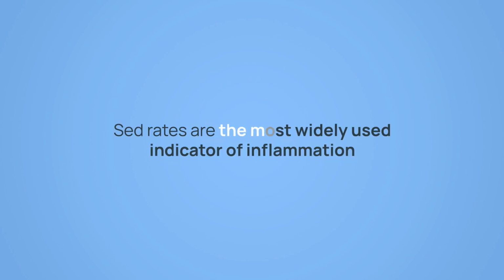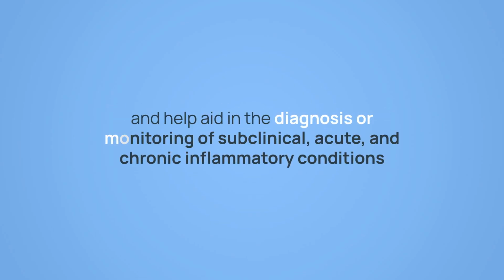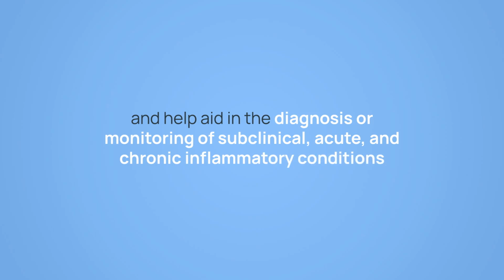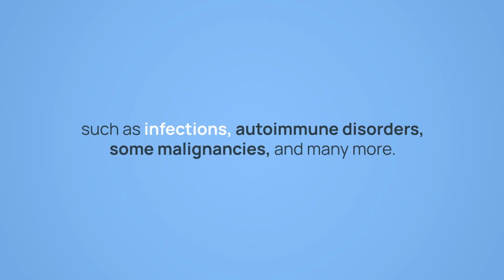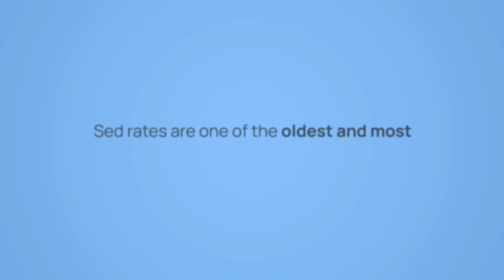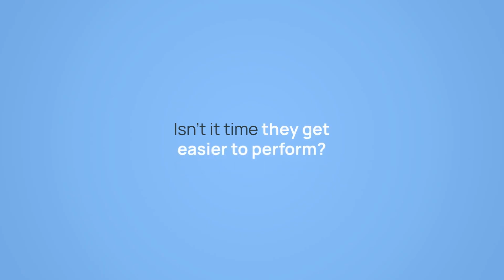SED rates are the most widely used indicator of inflammation and help aid in the diagnosis or monitoring of subclinical, acute, and chronic inflammatory conditions, such as infections, autoimmune disorders, some malignancies, and many more. SED rates are one of the oldest and most common lab tests in the world. Isn't it time they get easier to perform?